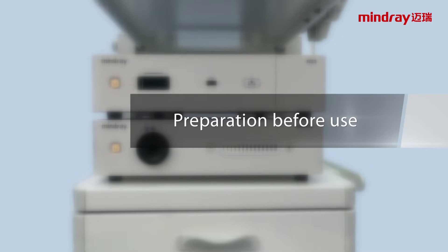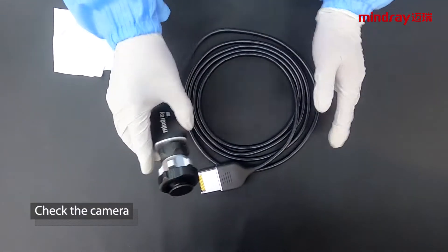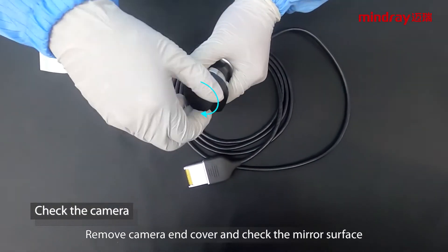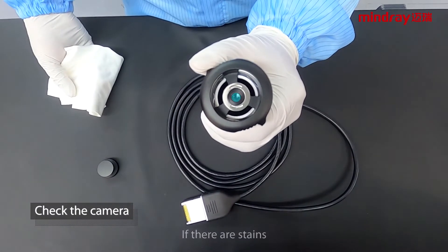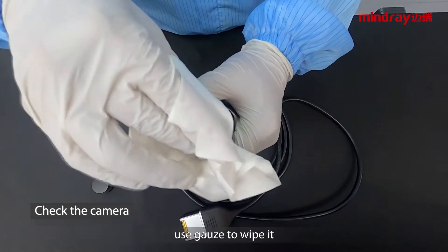Preparation before use. Camera check: remove the camera end cover and check the mirror surface. If there are stains, use gauze to wipe it.